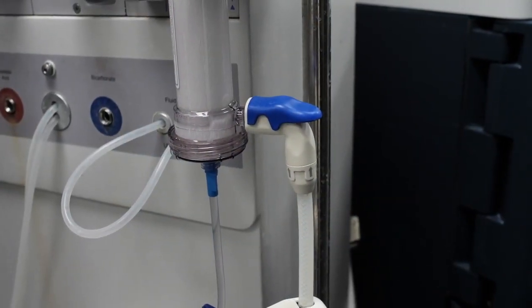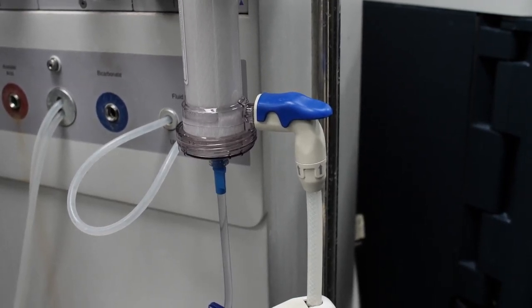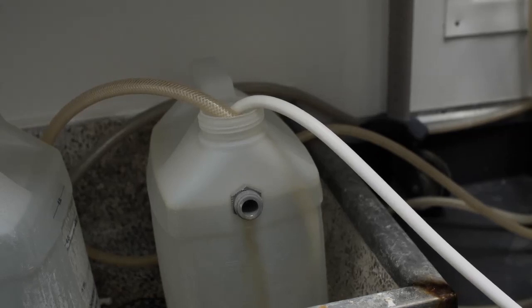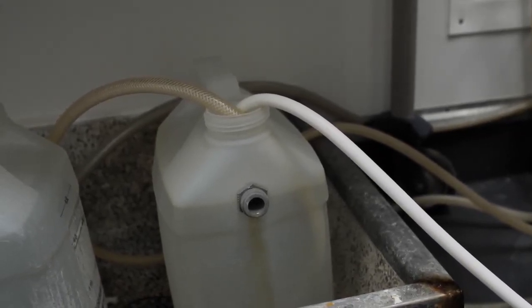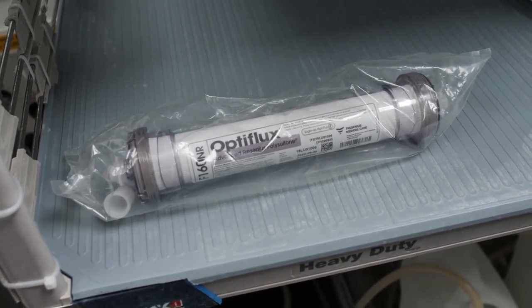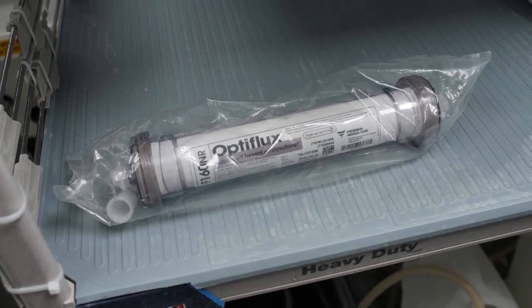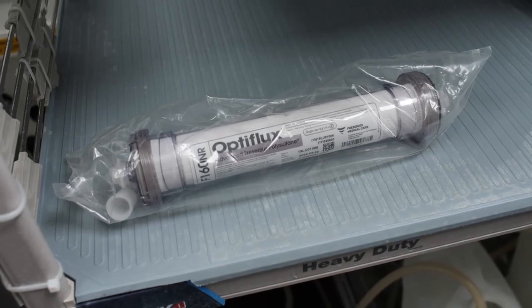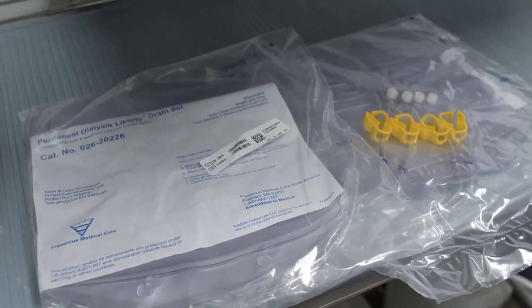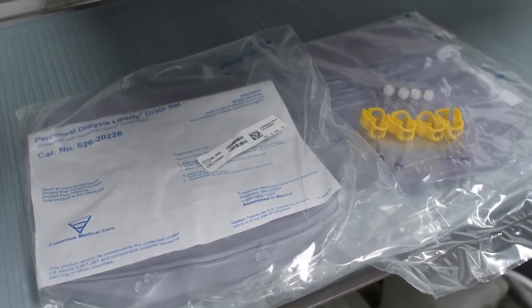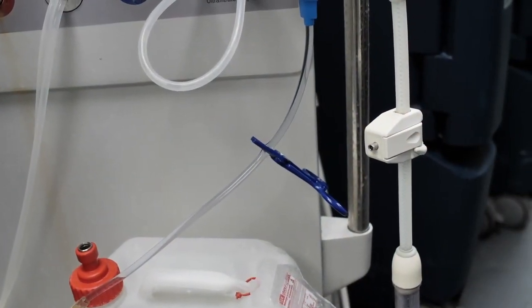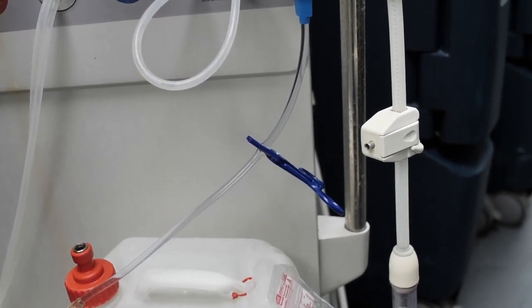The dialysate feed line is connected to one dialyser port while the unused dialysate port is capped during the procedure. The return dialysate line is placed into a container of replenishable water to complete a closed dialysate circuit. Dialysate is then inflowed at 800 mL per minute into the dialysate compartment of a high-flux, hollow-fiber polysulfone membrane dialyser, Fresenius F160 here, and allowed to transfer by back filtration into the dialyser blood compartment through sterile lines and splitter, from which it is collected into sterile 6 to 8 liter peritoneal dialysis cycler drainage bags. The non-draining side of the dialyser blood compartment is fed into a sterile line which is clamped during the procedure.